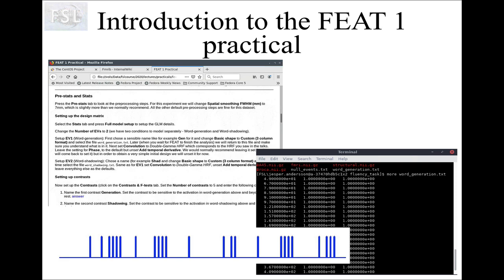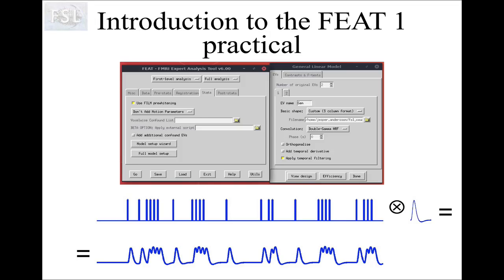After you have loaded the data and followed the instructions, you will start setting up your model. You will be asked to select a text file called word_generation.txt. This text file contains the onset times of the word generation events. For example, the first row tells us that 49 seconds after the start of the experiment is when the first word generation event is presented, the second after 67 seconds, and so on. FEAT uses this text file to generate a train of stick functions, as you saw in the GLM talk.